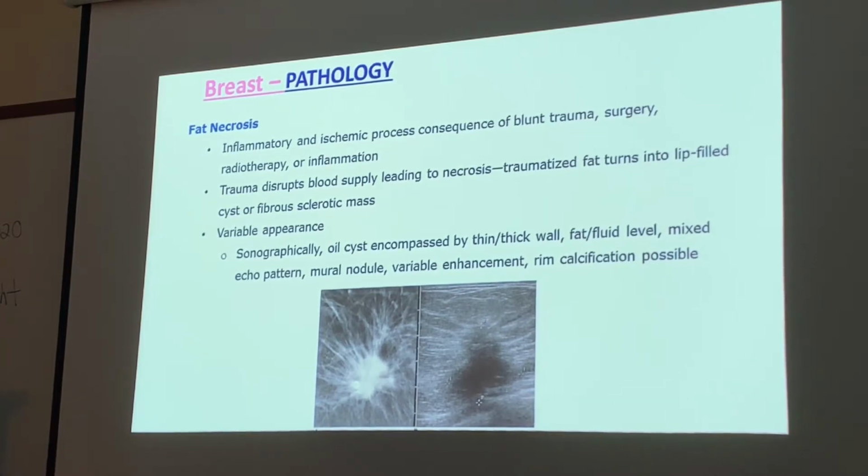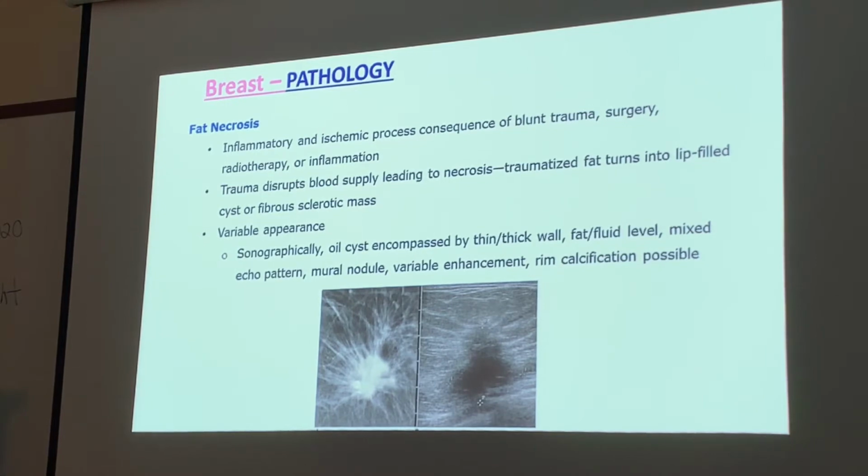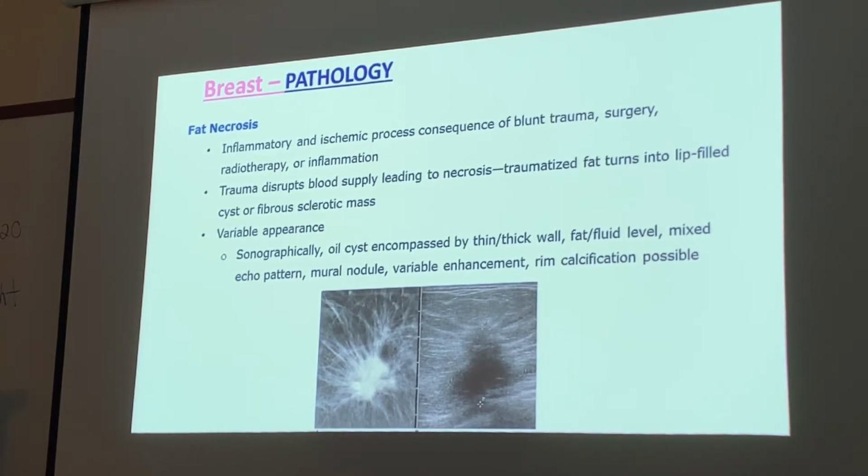Fat necrosis is an inflammatory and ischemic process, a consequence of blunt trauma, surgery, radiotherapy, and inflammation. So we have the mammogram right here, guys, and this is the ultrasound. The trauma disrupts blood supply, leading to necrosis.